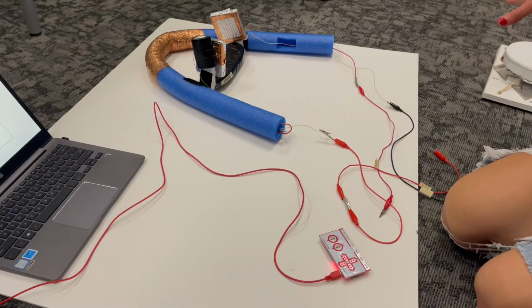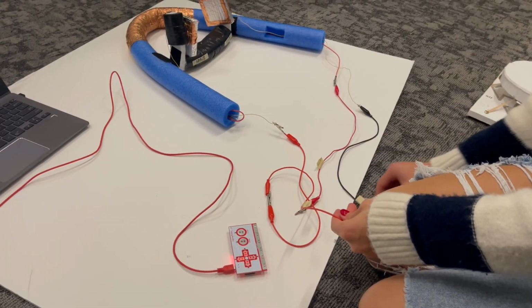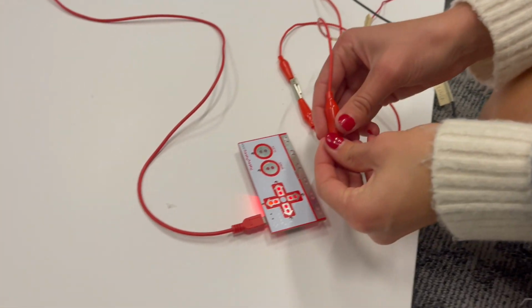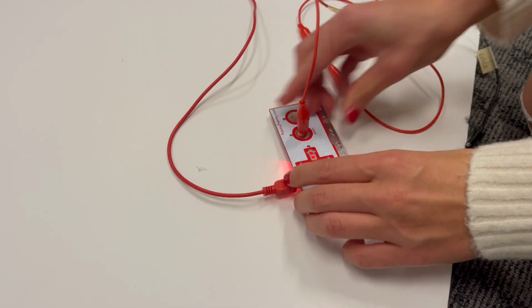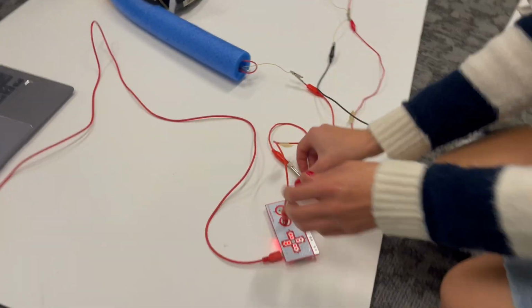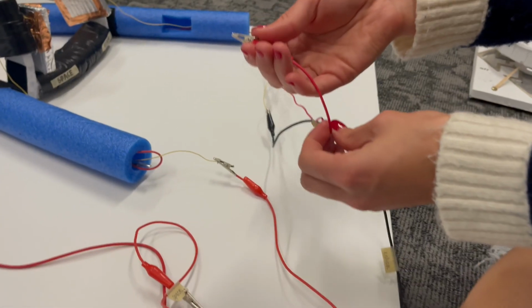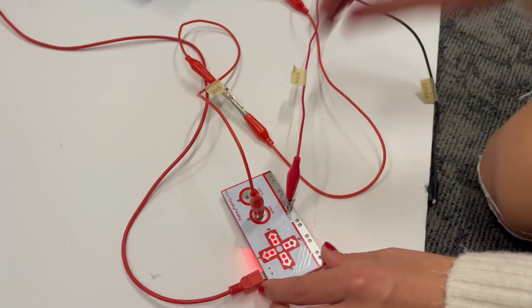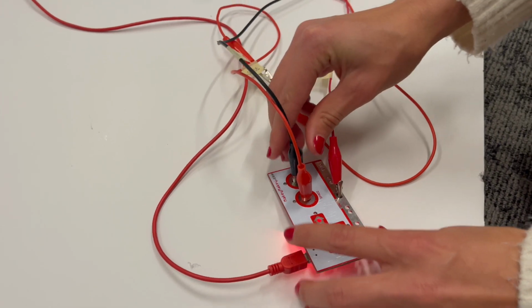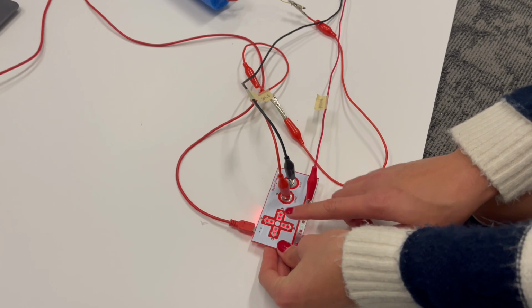So to use the Quadriplegia neck attachment, first you want to connect the space, click, and ground wires, and they're all labeled as well, so it'll be super easy to connect them. And if you need it to reach taller, you can always double up the alligator clips like so. And keep in mind that you will also have your foot connections over there.